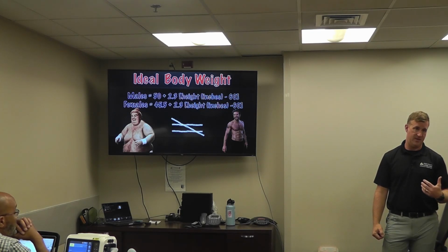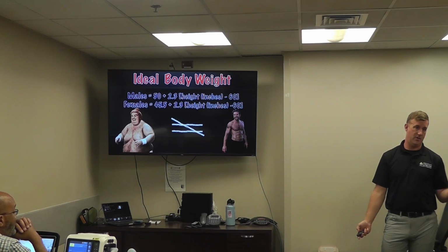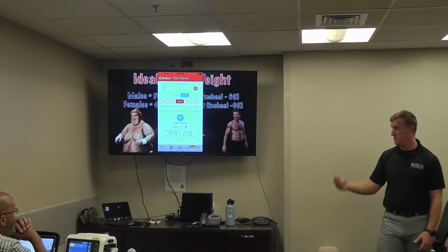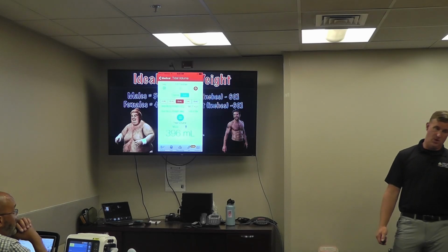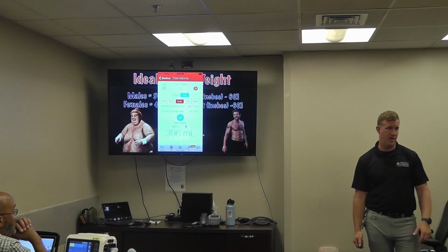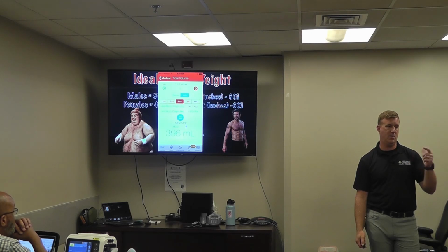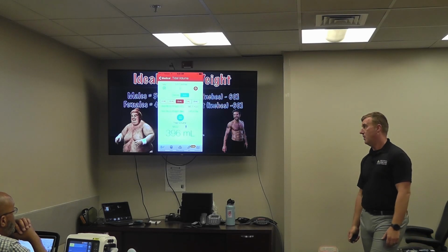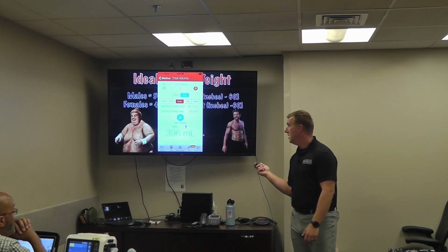I don't like math, so we all carry around more computing power in our pockets than they had in all the NASA missions or all the Apollo missions combined. So get an app, right? Fun fact: all of these T1s in front of you, you can program ideal body weight on that very first screen. It gives you that height. You program the height, it will give you ideal body weight. Okay, that's how important it was. That the Hamilton people said, we're going to put it on the front screen.